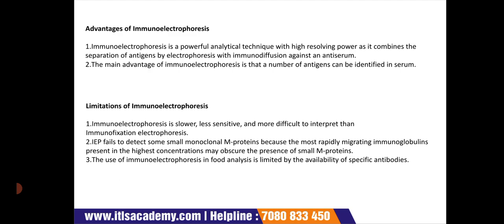Then let us understand the advantages of immunoelectrophoresis and its limitations. Immunoelectrophoresis is a powerful analytical technique with high resolving power, as it combines the separation of antigens by electrophoresis with immunodiffusion against antiserum.